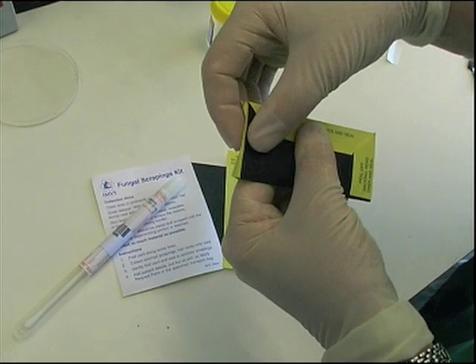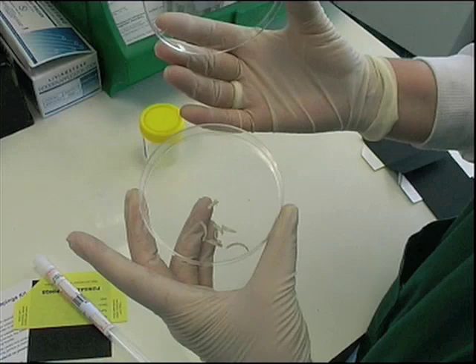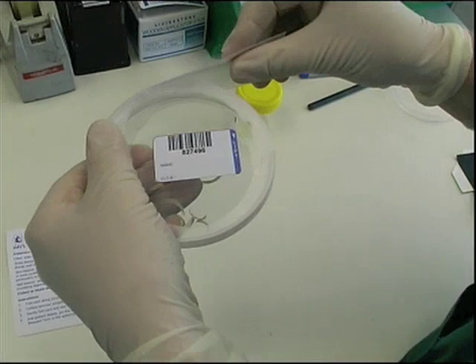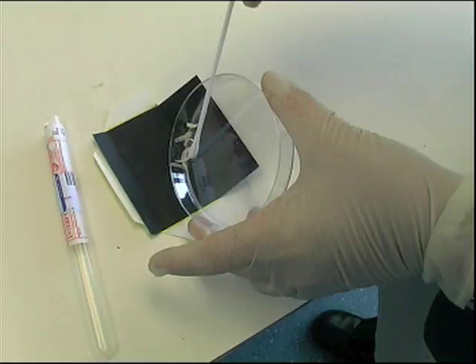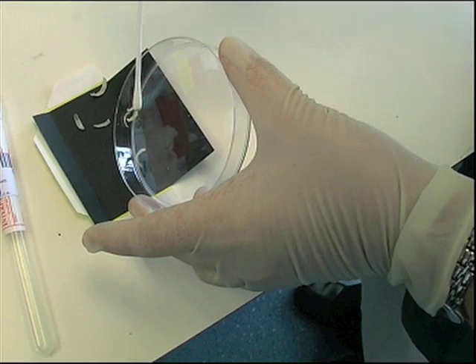Do the same with the two side flaps. Finally, make sure that the card is properly sealed and labelled for transport to the laboratory. Nail specimens may also be collected into plastic universal containers or into plastic petri dishes. If a plastic petri dish has been used to collect the specimen, then it should be carefully sealed using parafilm. Sticky tape should never be used to seal petri dishes. The only reason for transferring a specimen from a plastic container to a black card would be for transport via the mail.